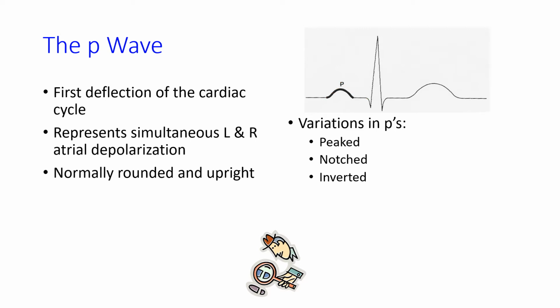It's the same on the left atrium. What we can develop is a notched P wave, which kind of looks like a little M, and that is P mitrale. That's usually due to left atrial enlargement. And again, anytime you change the structure or the dynamics of the heart structure, you will have a different pathway or a different look of that impulse as it travels through the myocardium.